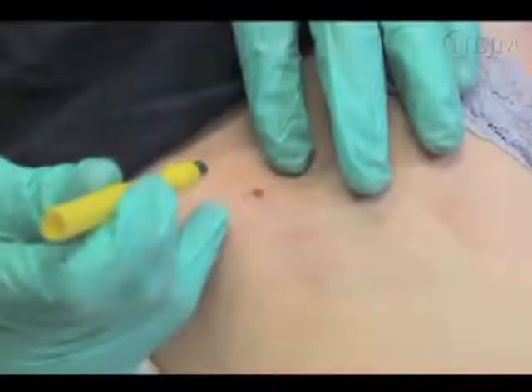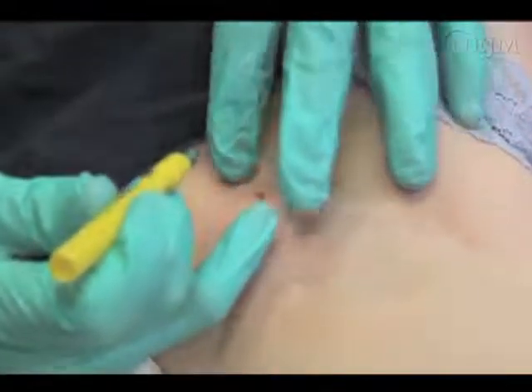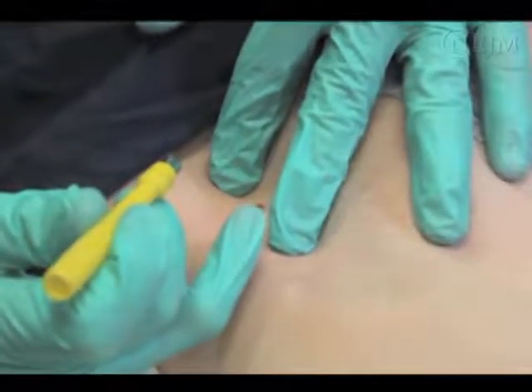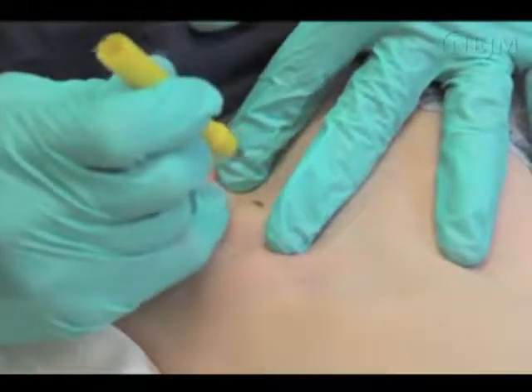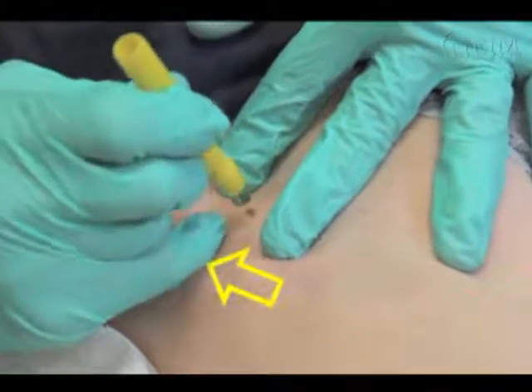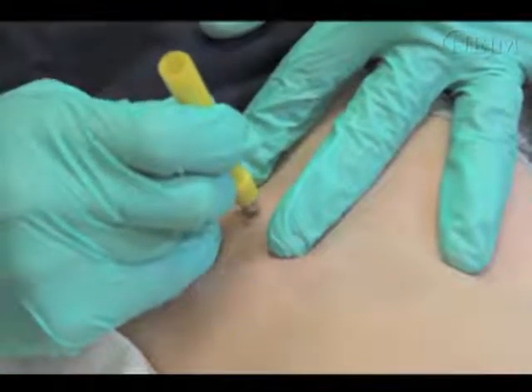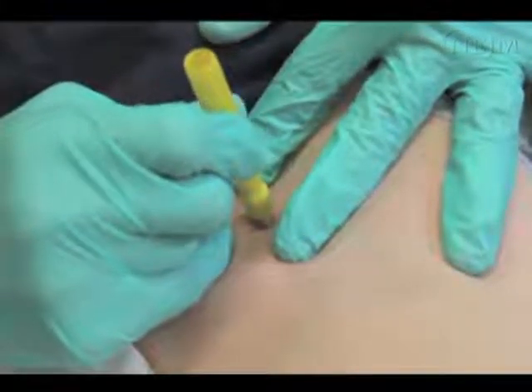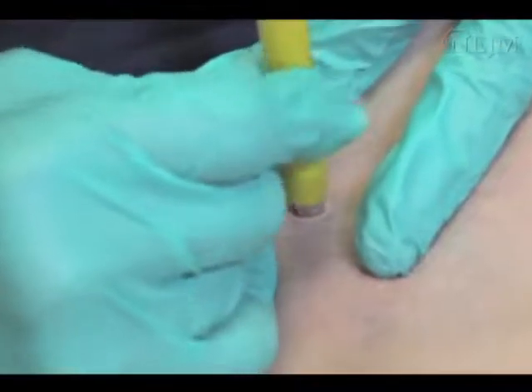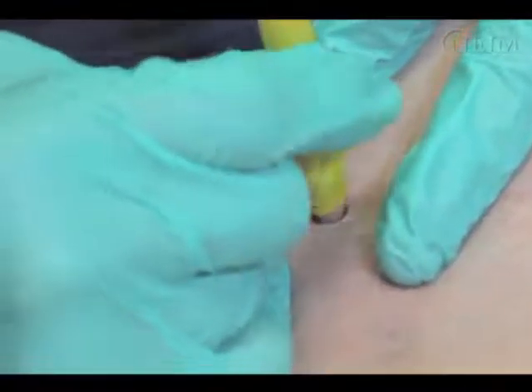The procedure is broken down into the following steps. Stretch the skin perpendicular to the skin tension lines, which results in an elliptical wound after the punch, minimizing puckering once sutured. Hold the punch in your hand and place the fifth finger of that hand adjacent to the lesion for stability. Position the punch over the lesion — for pigmented lesions, use your imprint as a guide. Apply rotational and delicate downward pressure on the punch until you feel the give as it enters the fat layer.